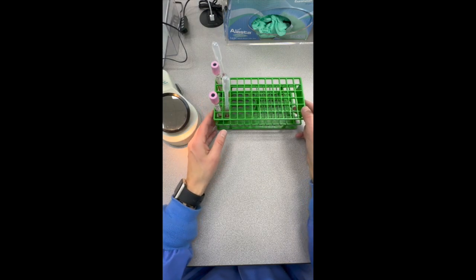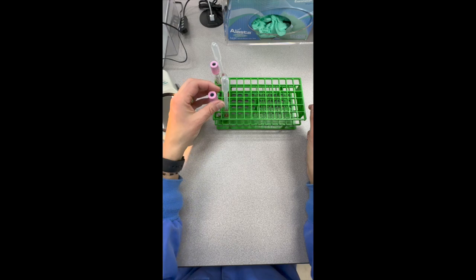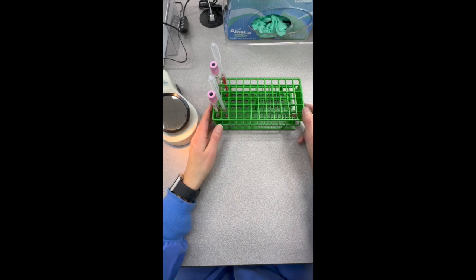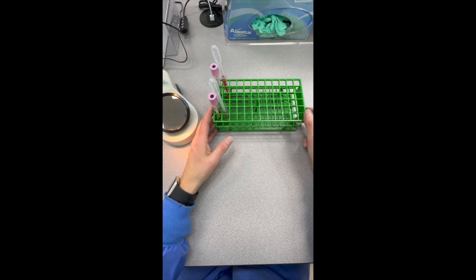Hi everyone. So today what we're going to do is look at two specimens, and we're going to do an example with a weak D, or you may hear DU. That was an older term that was utilized, and most of the time now you're going to hear weak D. And there are a couple instances where you would do a weak D test.